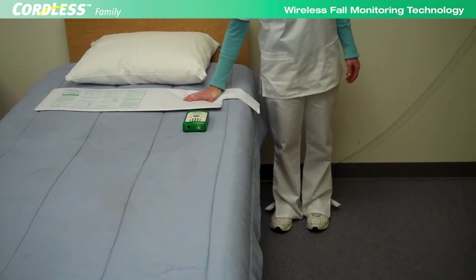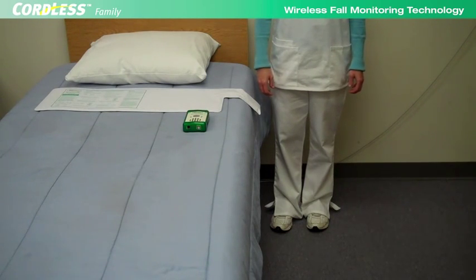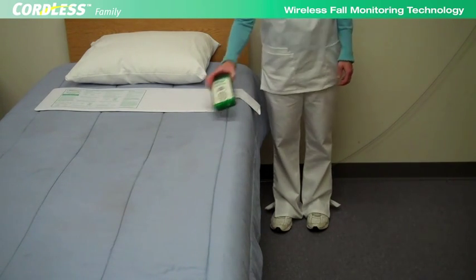The cordless system components are designed to work in demanding environments with quality electronics, high-impact plastic cases, and protective boots.